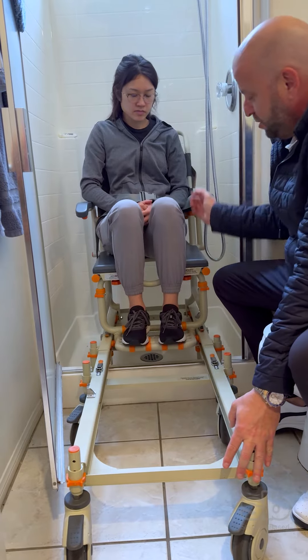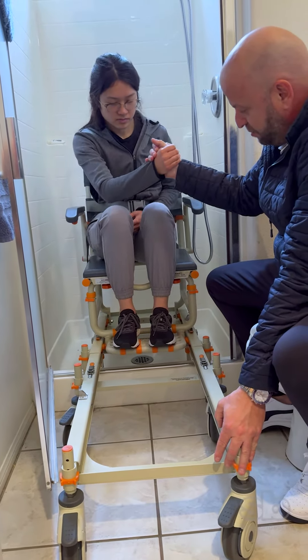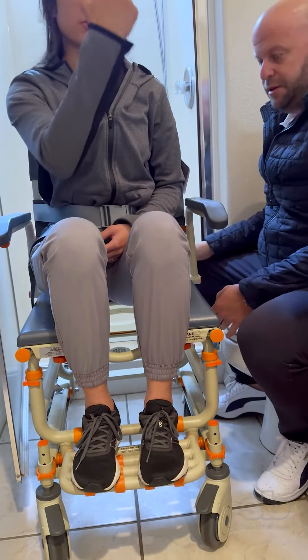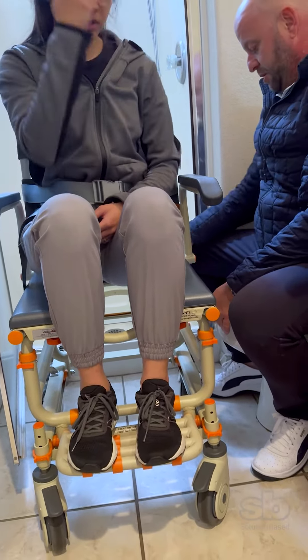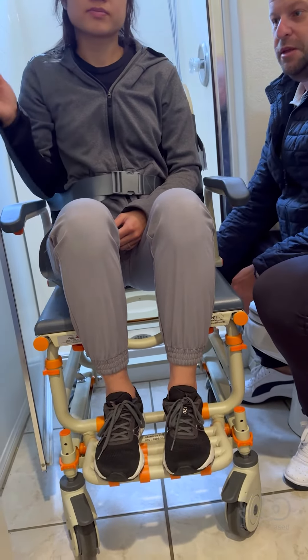Michelle, grab my hand — just to show you, go ahead and just pull yourself. How easy that slides. Because your right hand is your good side, you just pull. And the door for privacy does close.